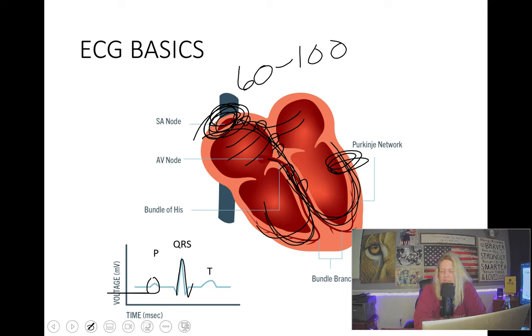And ventricular rhythms start in the ventricles, like ventricular tachycardia and ventricular fibrillation. There's no P wave and the QRS is wide with the ventricular tachycardia. And I will do separate things on atrial rhythms and the ventricular rhythms, okay? So I hope this was helpful to you. I know it's not always easy, but you do have to be able to grasp these basic concepts before you can really start to understand some of the other rhythms.